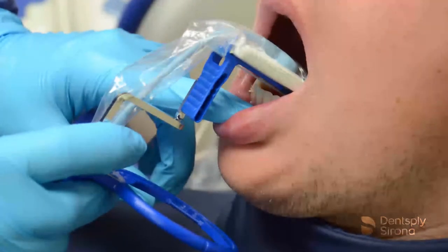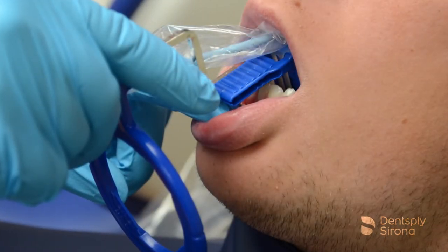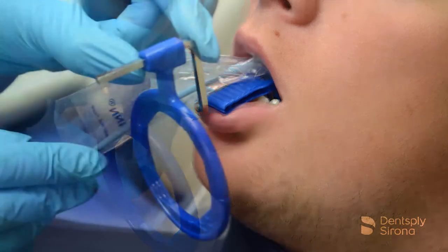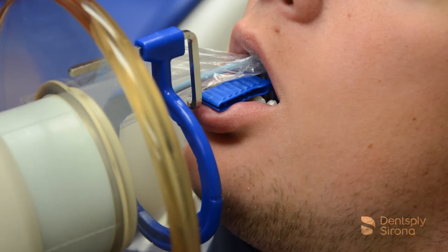Continue capturing images of the mandibular anteriors by positioning the image receptor in the same manner used for the maxillary anteriors. Center it behind the teeth being captured, instruct the patient to close slowly, and align the handheld portable x-ray device. The image is now ready to be captured.